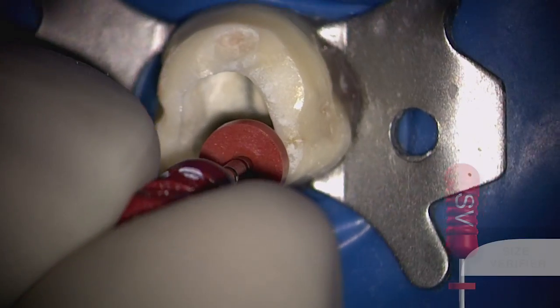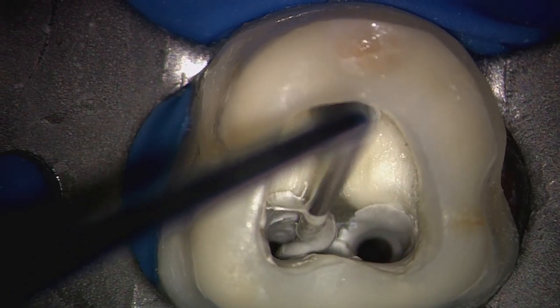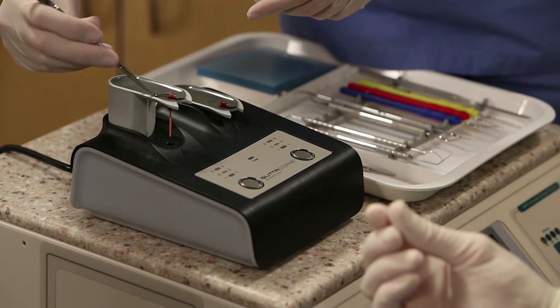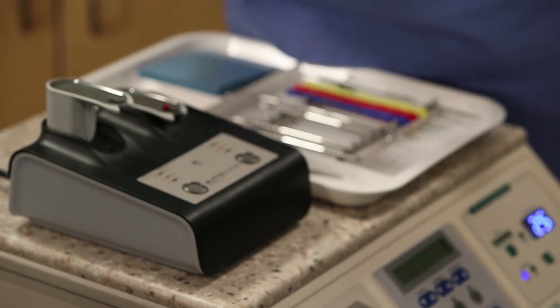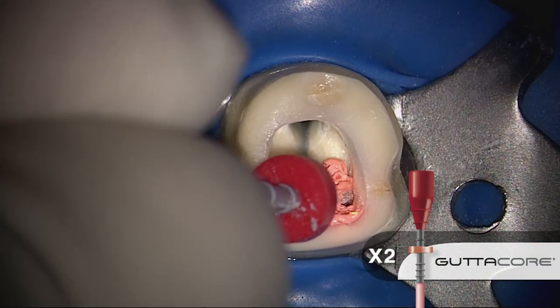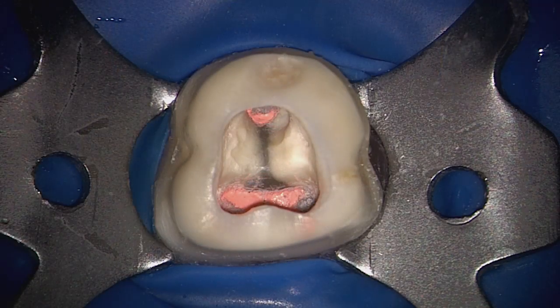Here, I'm using a size verifier that must match the last ProTaper Next file that was carried to length. Mix the sealer of your choice, and insert it into the canals. And now we can use a Gutacore obturator. Coming out of the oven, there's sufficient thermal plasticity with the material that allows it to easily slide to length. Once this obturator has been carried to length, rock the handle gently back and forth to separate the coronal aspect from the radicular part. Flush out the tooth in preparation for provisionalization.